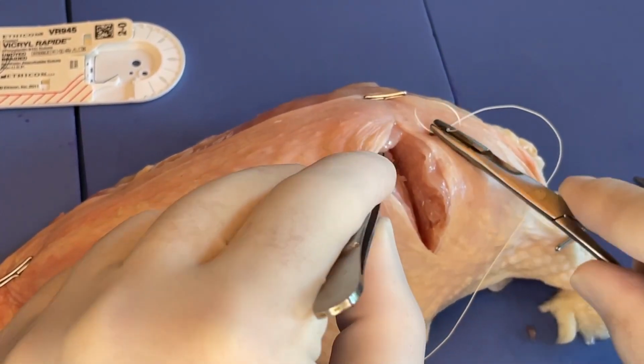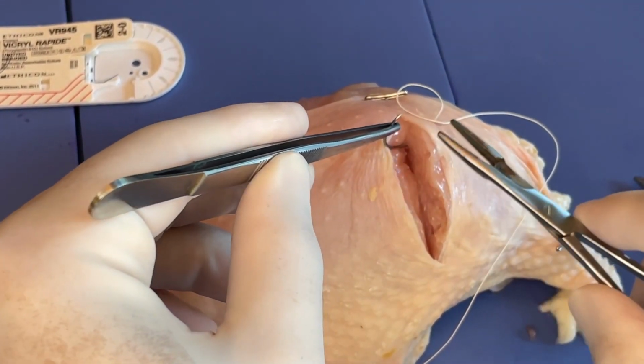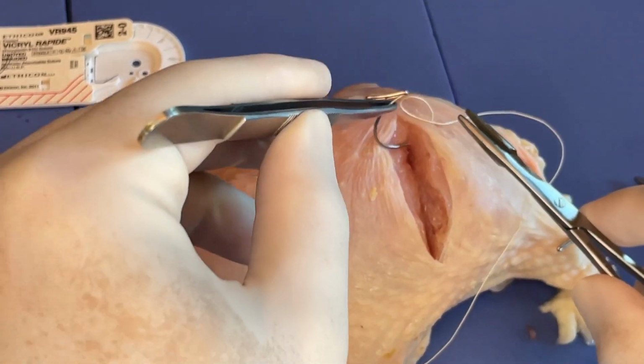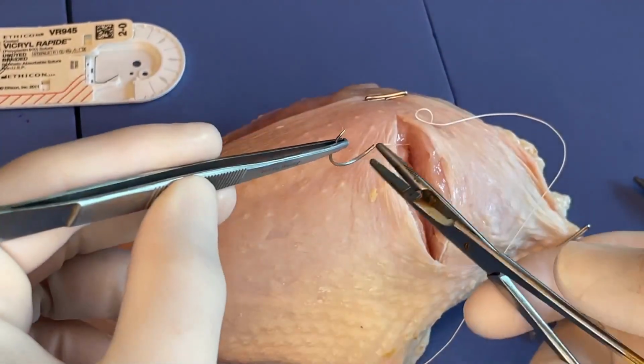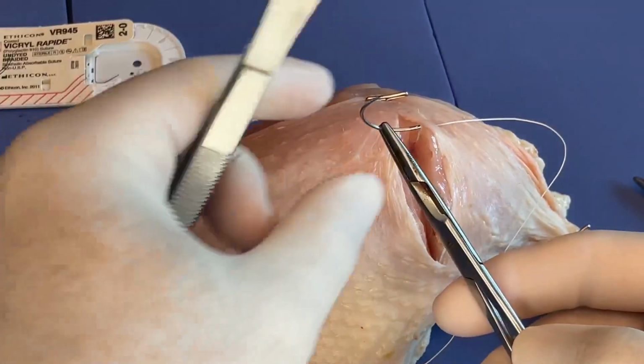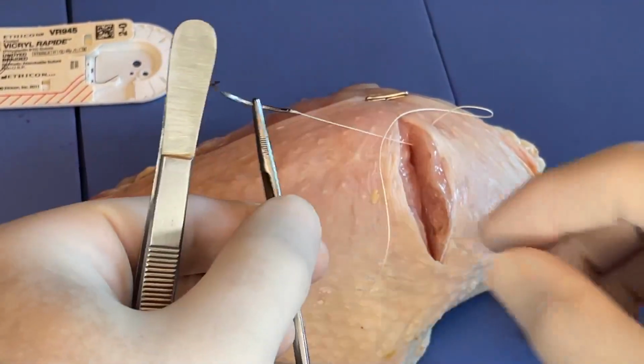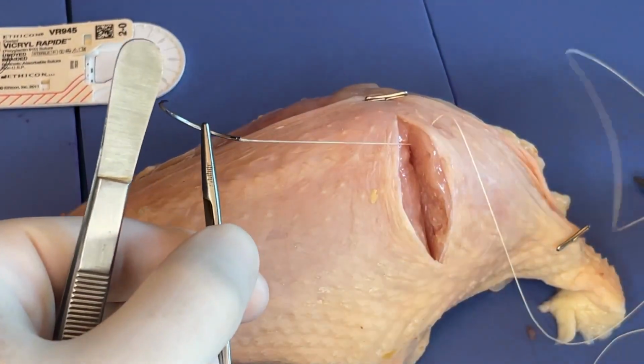You can see here in the middle of the tissue, grab with our forceps, and oftentimes if the tissue is soft enough, we can just kind of curve that needle out with the forceps and then just reload it here at the skin. What we'd like to do is avoid really having to grab the needle with our fingers and then increase our risk of poking ourselves.